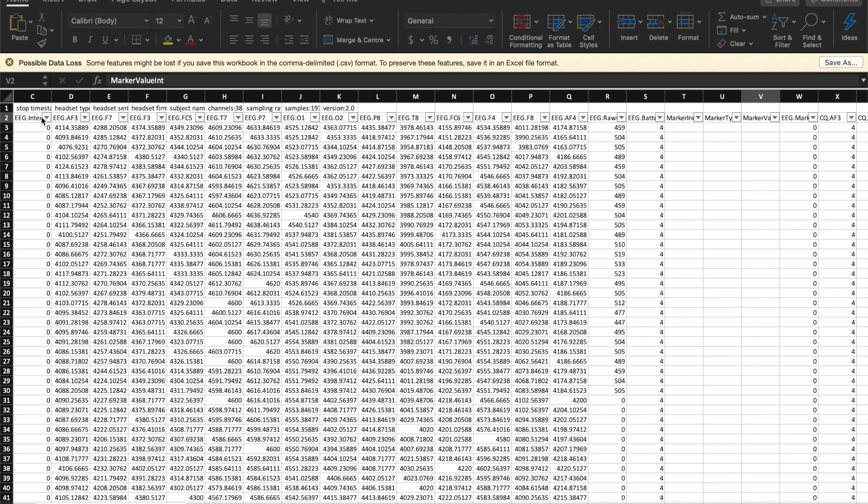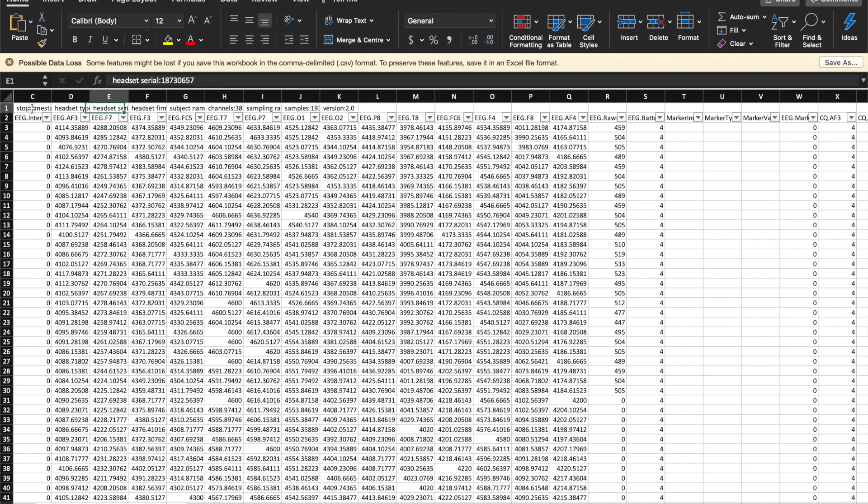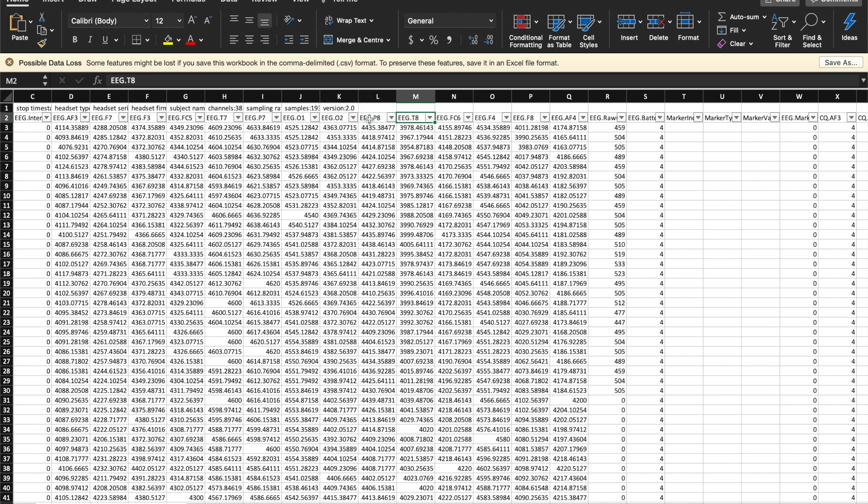I have opened the CSV file that we have just created. Here you can see that it is not a standard CSV in that the first row contains some information about the recording and the column headings are in the second row. So for processing, you will need to either delete the first row or skip it when you read the file.